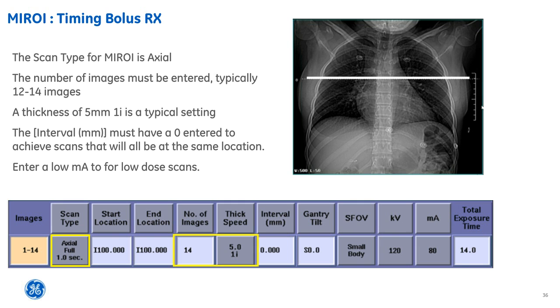So we would find our delay. In the case of this patient, it was 19 seconds, and we would type 19 seconds in here. If we were scanning, in this instance, a CT pulmonary angio, we would trigger our contrast and our scan off at the same time, and at 19 seconds the acquisition would start. So it works in the same way as when we have a timing delay for our portal images.